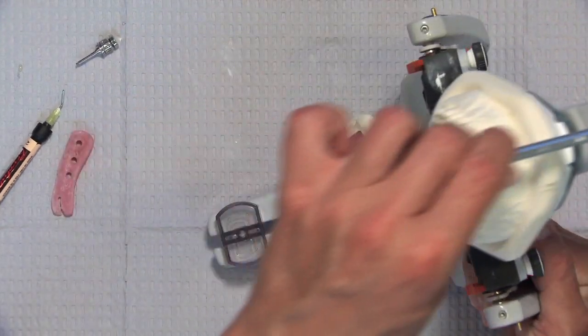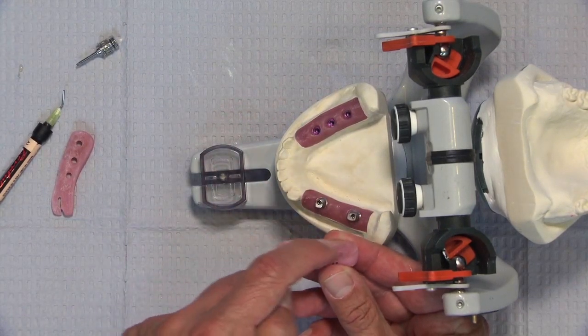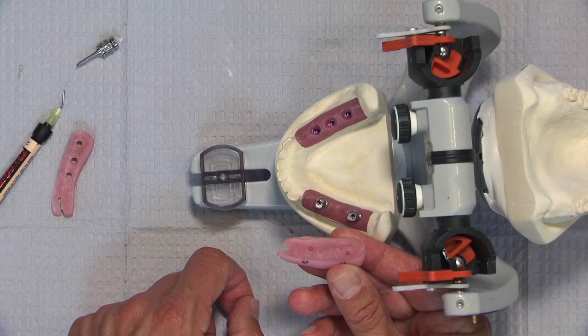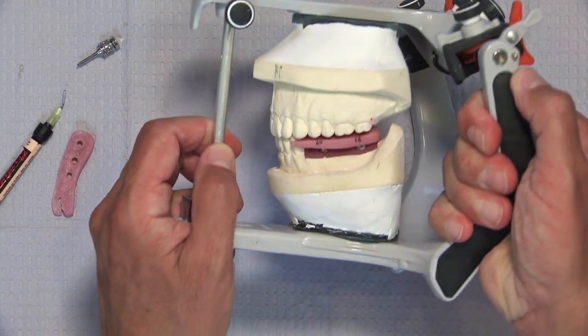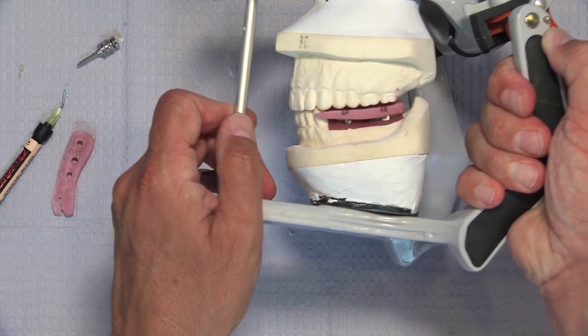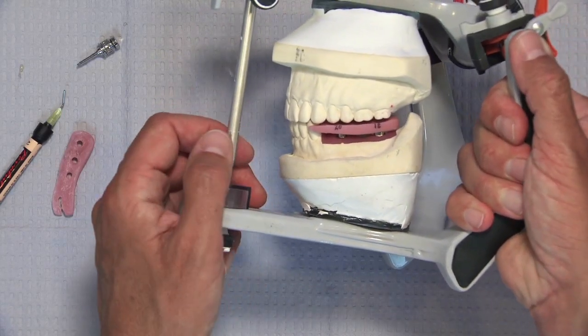So at that point, we take the index out and do what I've already done here with a watermelon burr, and that is grind away all the occlusal anatomy that was already there. What we want to do is assure that the patient is now freely biting together and closing, and you can see all the space that we have here between the opposing teeth and the guide itself. In fact, there's no contact at all. We want them to freely be able to close.